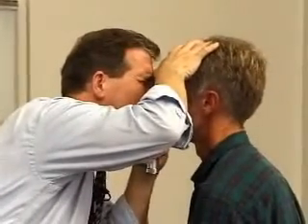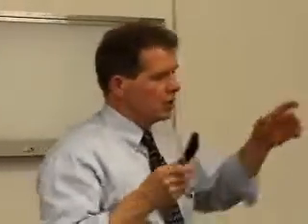With the unique number on and the same exact positioning, only this time, if the patient is staring at something straight ahead and horizontal, and if the examiner comes in relatively anterior, looking through the pupil, they will land right on the retina — and that's exactly what I was able to see. So it's the exact same positioning, patient looking ahead. Notice this time that when I have his retina in good focus, watch how close I am to get a good size of visual field.